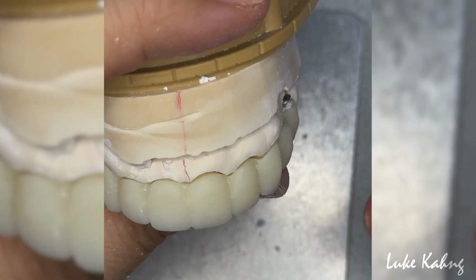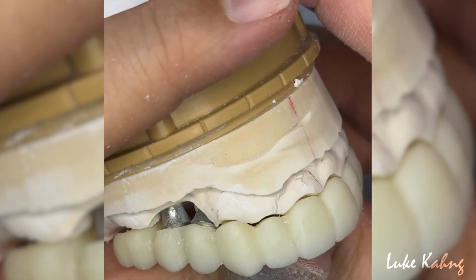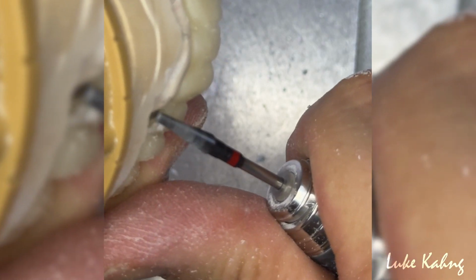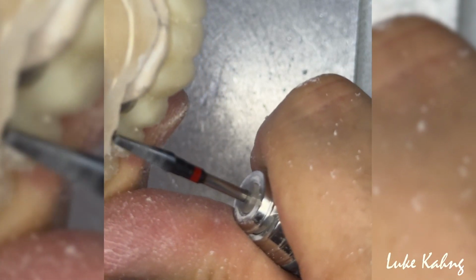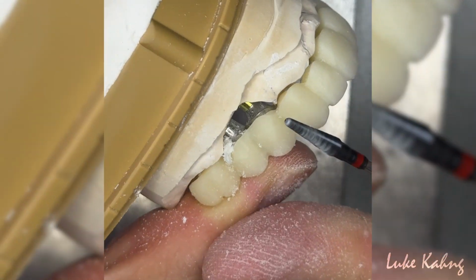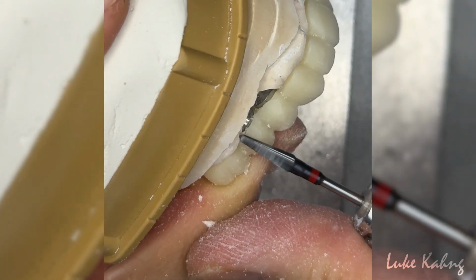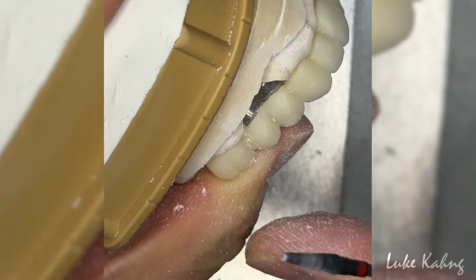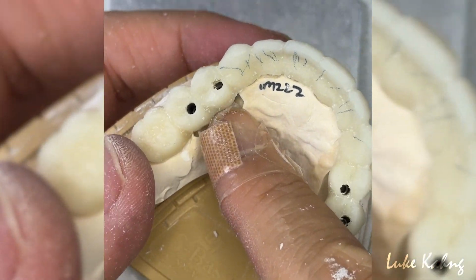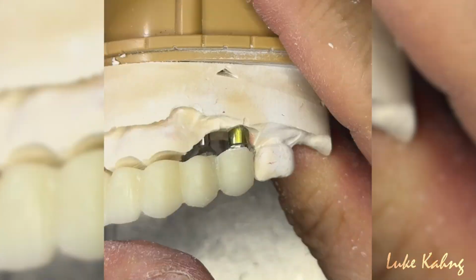So probably we don't need any pink porcelain. I'm trying to make a lifelike restoration from the gum and adapt with my temporization. Once they are satisfied with this, and if they're not, maybe they cut it here, cut it there, not a problem. This is a guide. Not only this, the doctor will go and take the new impressions. The tissue area will be just beautiful.